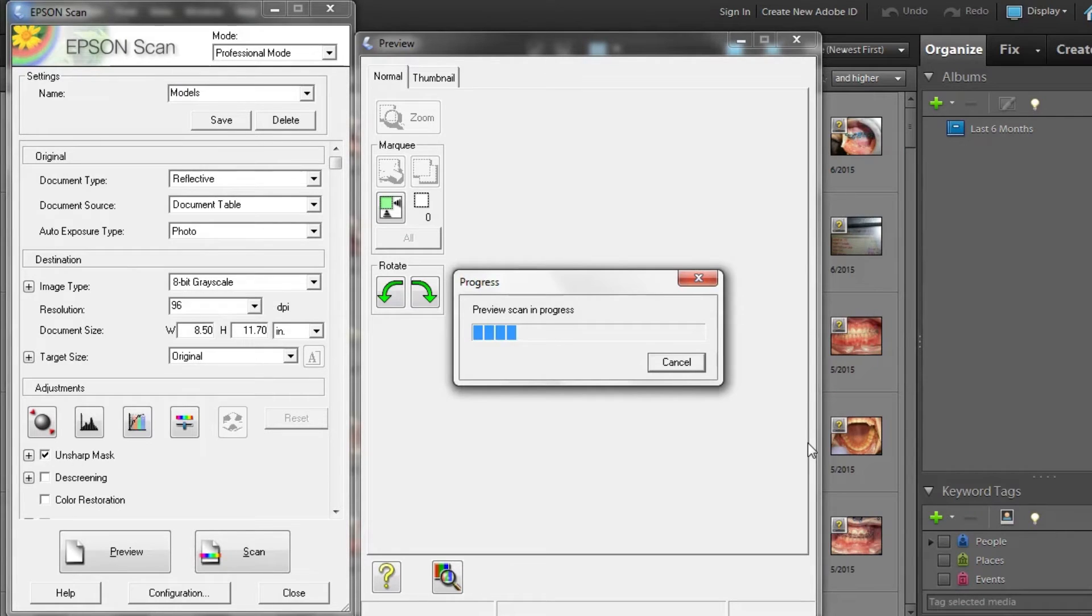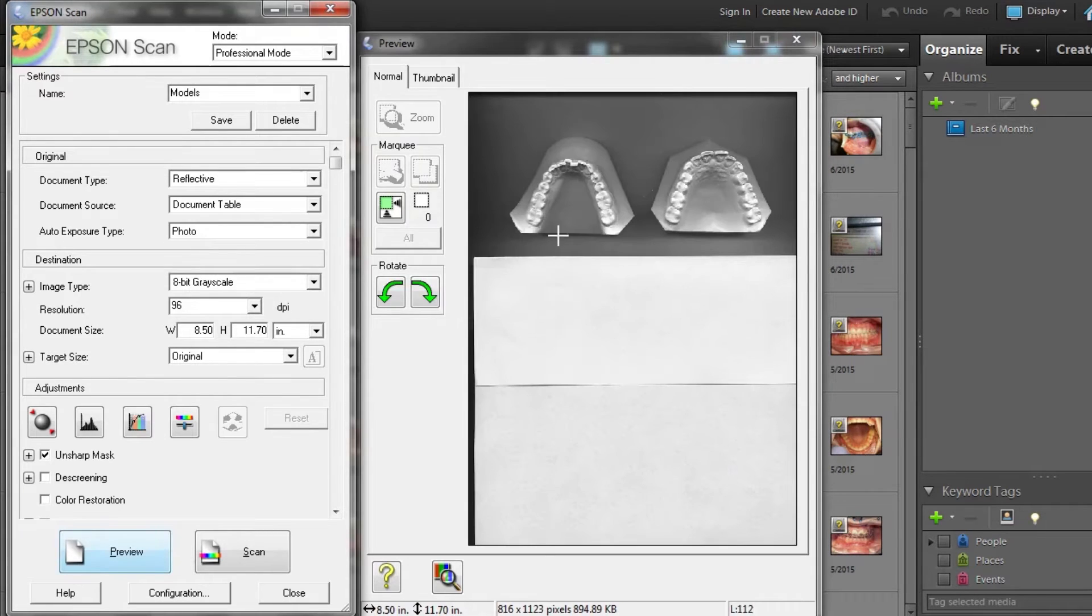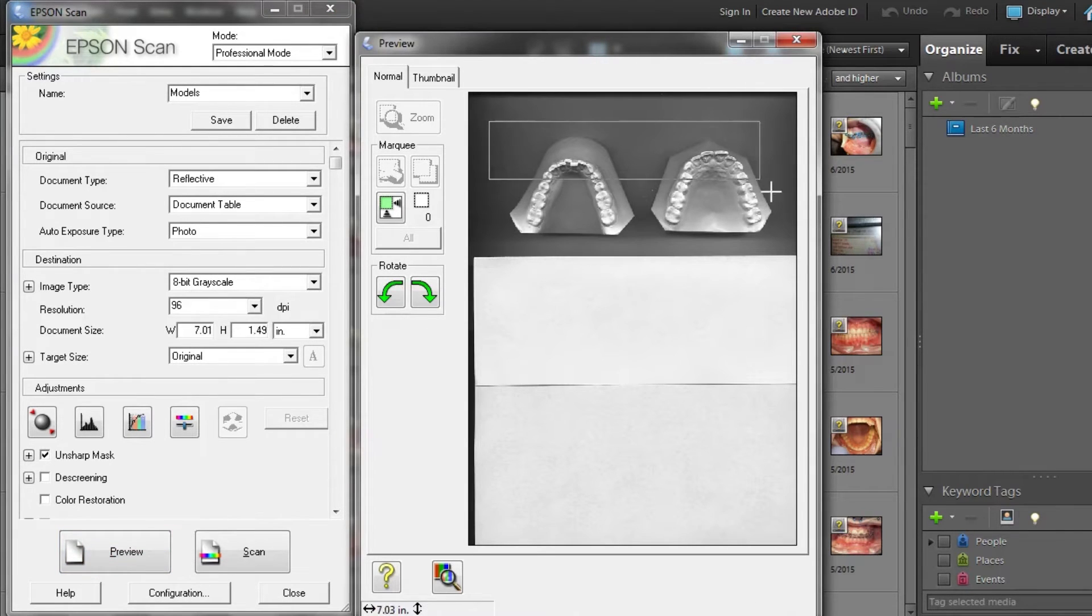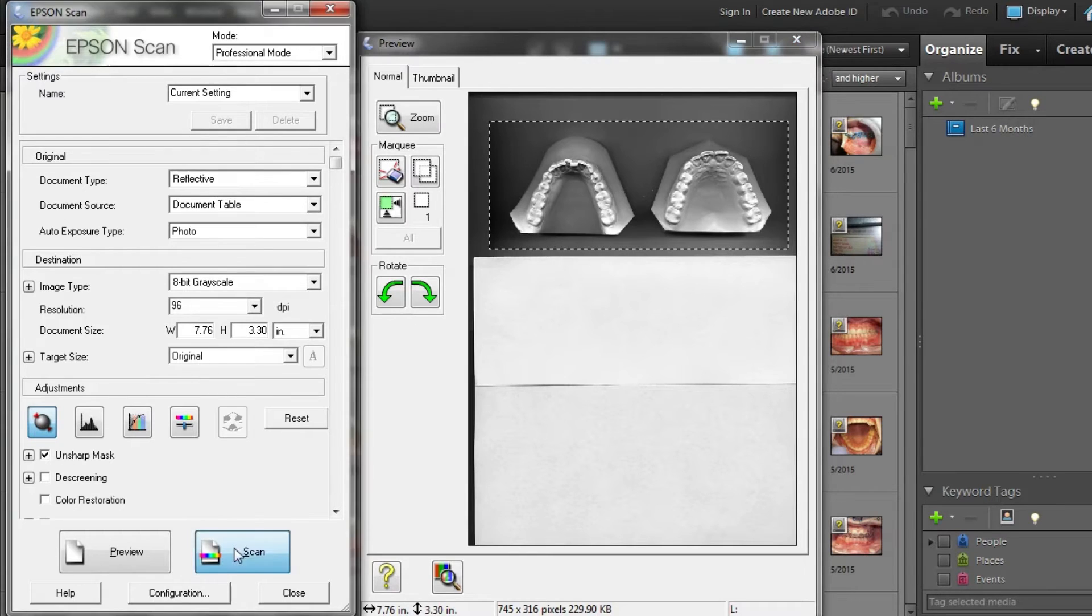Once you have a preview that you like, crop the scanner area to the desired view and select Scan.